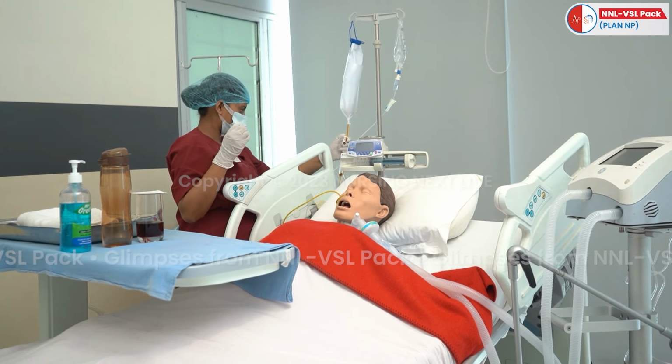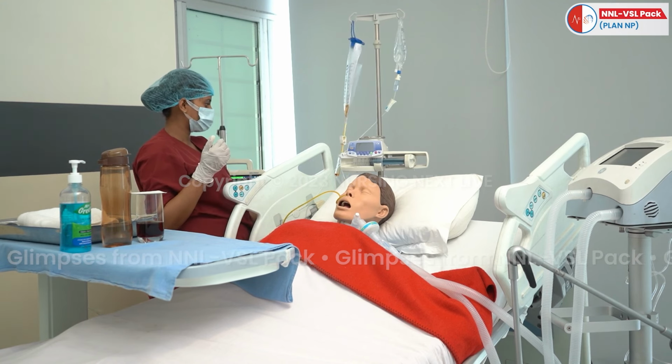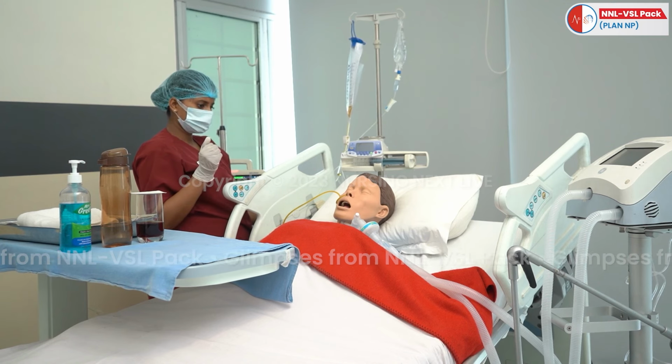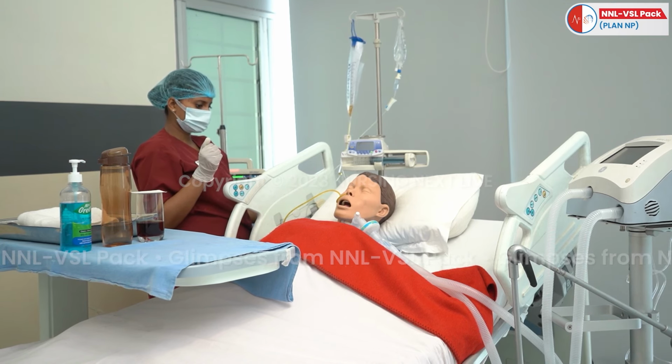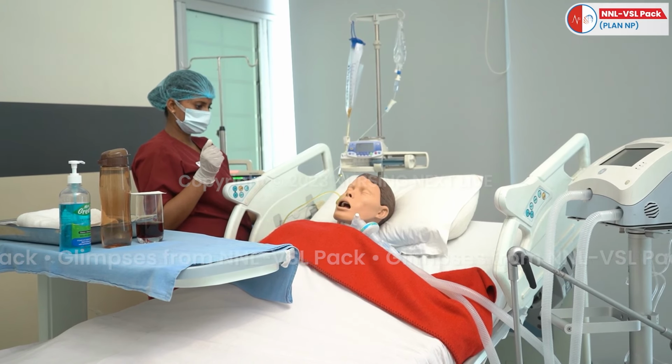Post-flush the NG tube. Kink it, detach and close the cap.